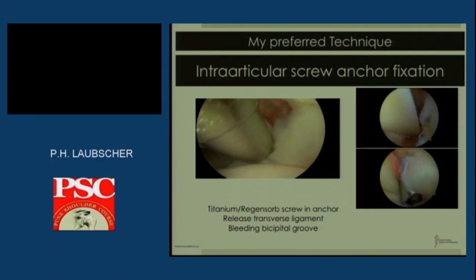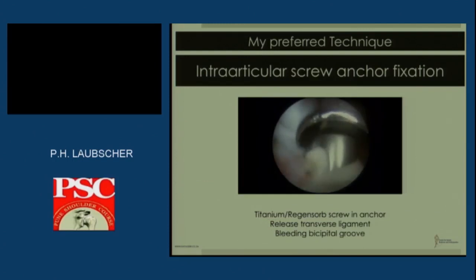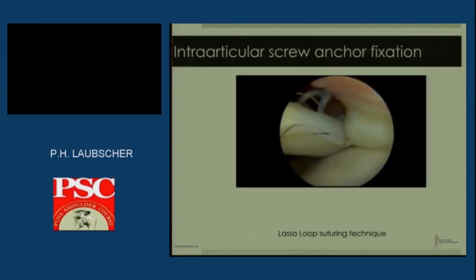With that previous technique, I'm sure you noticed that the tendon is very close in proximity to my shaver, and so the risk with that technique is that you can shave your biceps, and I will show you an additional technique.